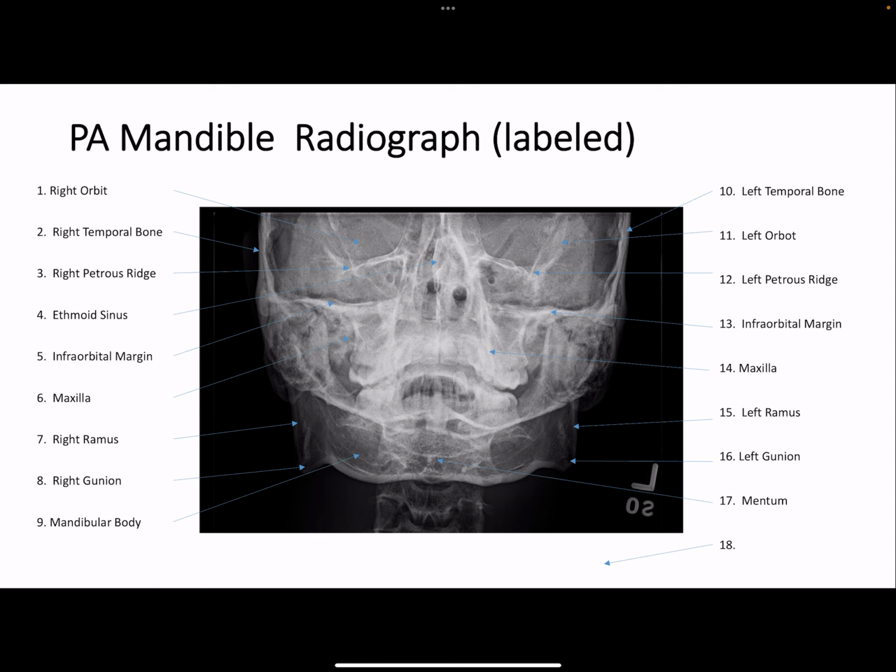KVP range for this patient was 75 to 90 KVP. Instructions to the patient. As I took this image, I instructed the patient to not move, to hold his breath. I took the image and then told him to breathe and relax. Anatomy demonstrated. The PA mandibular rami and lateral portion of the body are visible.